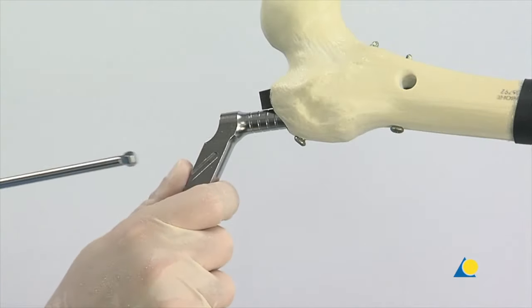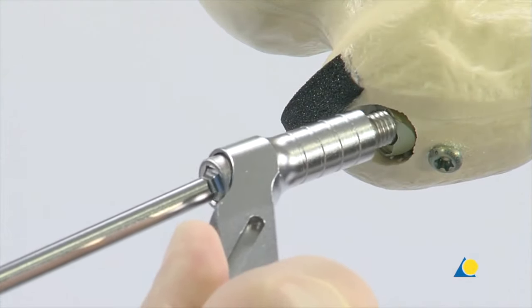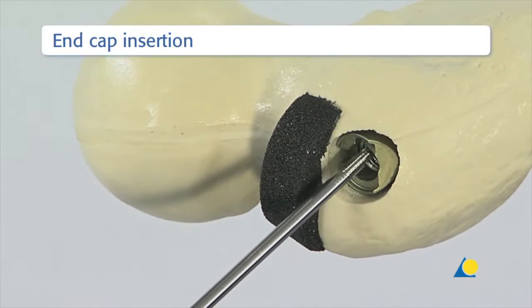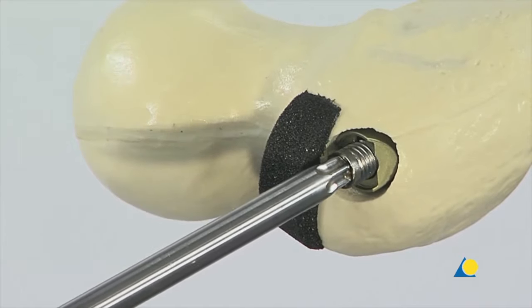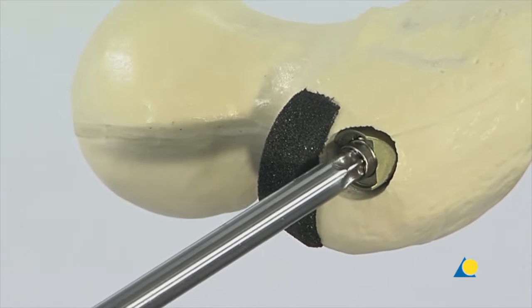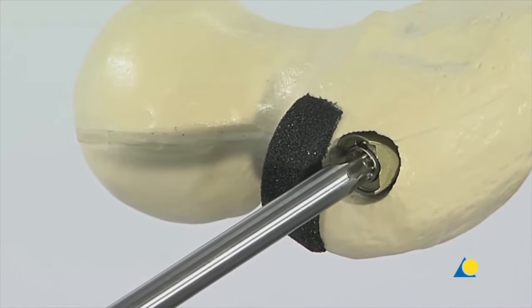The insertion handle and the aiming arm are removed together by loosening the connecting screw. A cannulated end cap can be inserted to prevent bone ingrowth or to extend the length of a nail that has been over-inserted. The end cap is first turned anti-clockwise until its thread aligns with the thread of the nail, then screwed into the nail with clockwise turns of the screwdriver.